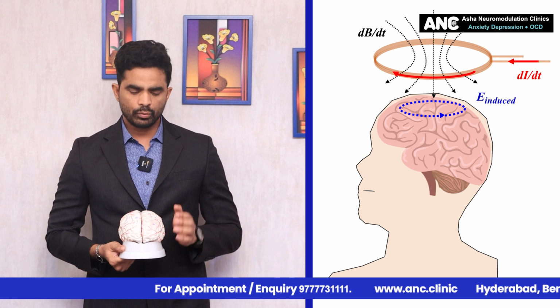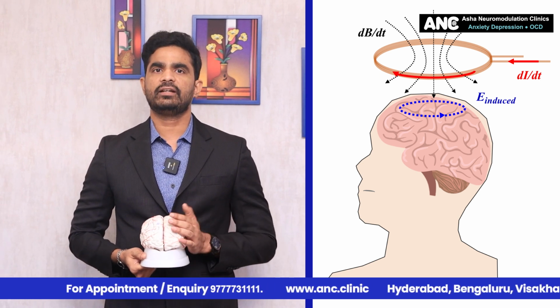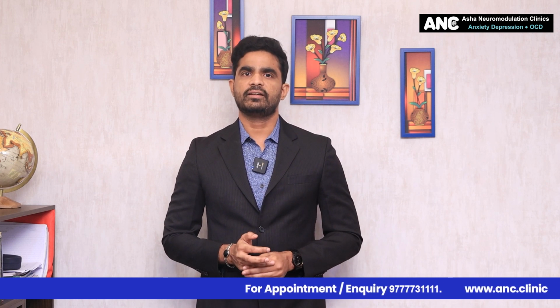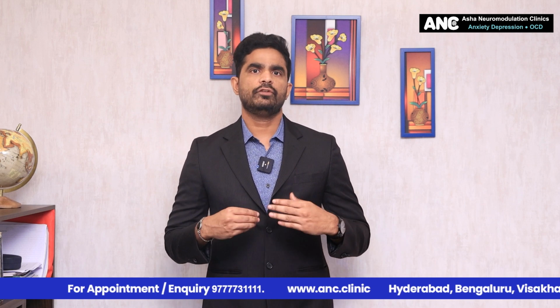Got it? So now we have discussed the classical effects of the induced electric field on the brain. Now what about the non-classical effects? The non-classical effects are directly due to the magnetic field which is going to affect the neurons. Viewers, let me tell you, these non-classical effects are really awesome to look at. But as of now, there is not much evidence for it, but this is a possibility.